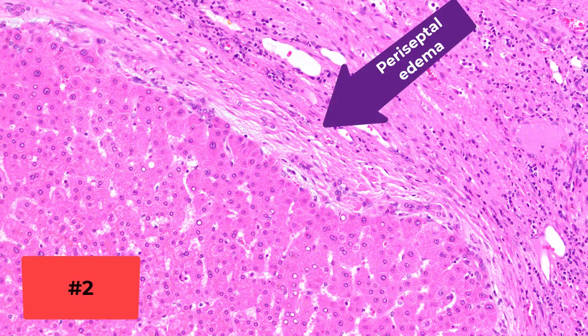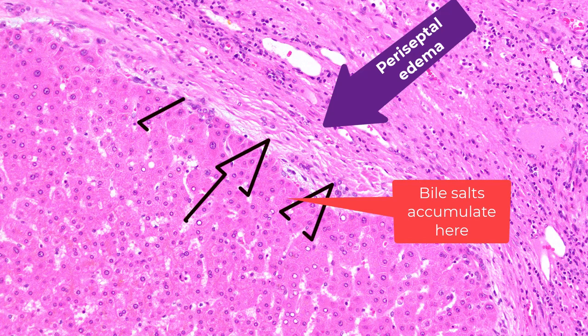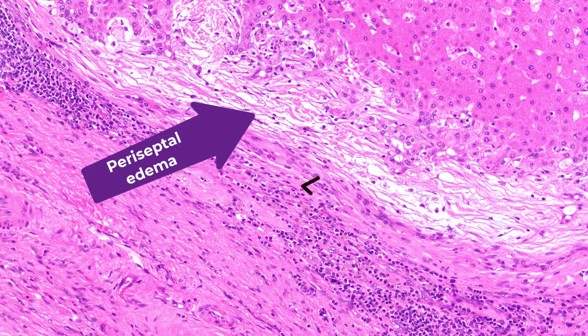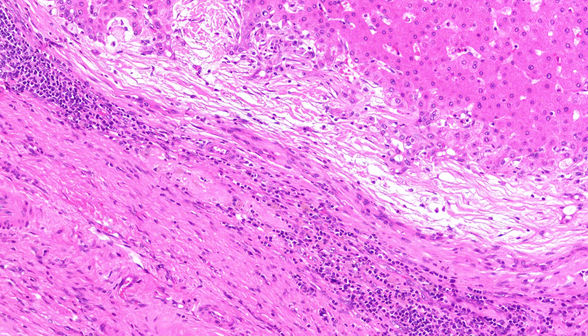Feature number two: note the edema adjacent to these regenerative nodules. This edema is created by the retention of bile salts. Unfortunately, the liver simply can't get rid of these bile salts and they accumulate in the periceptal hepatocytes. So feature number two is this edematous look around the hepatic nodules — a halo-like appearance around the nodules.